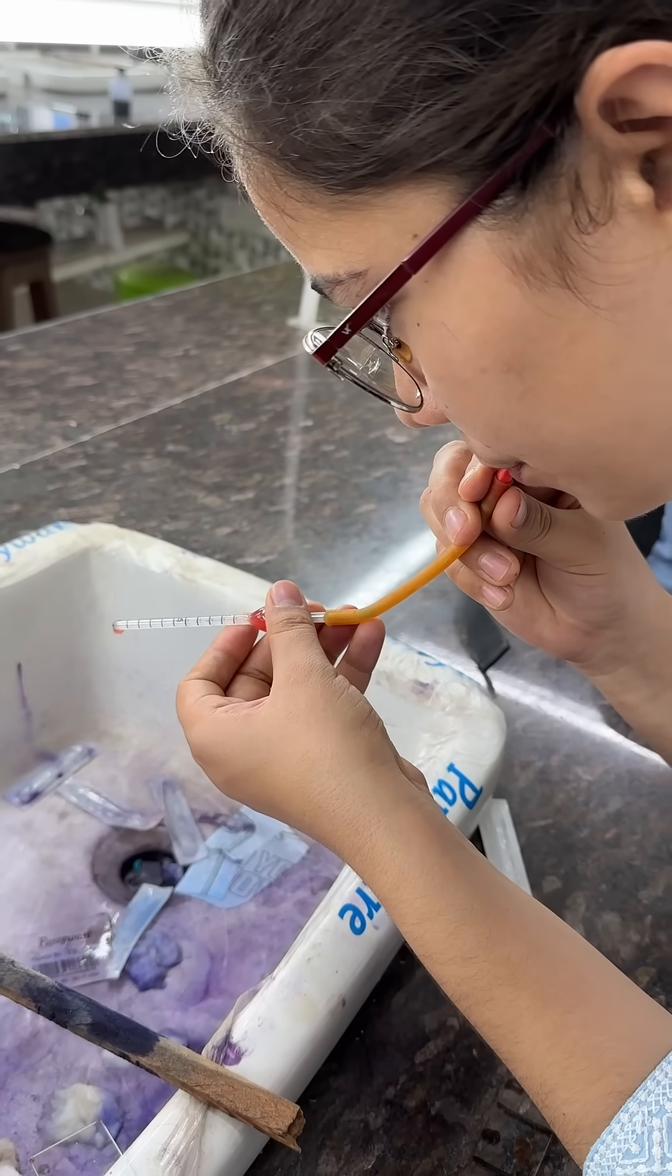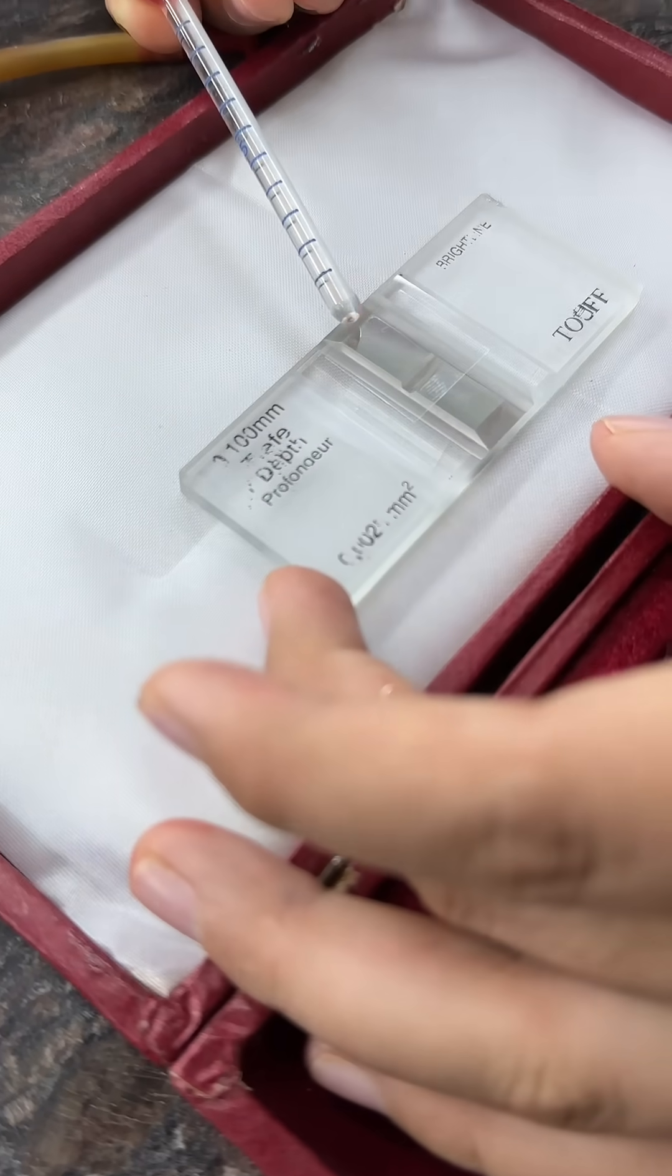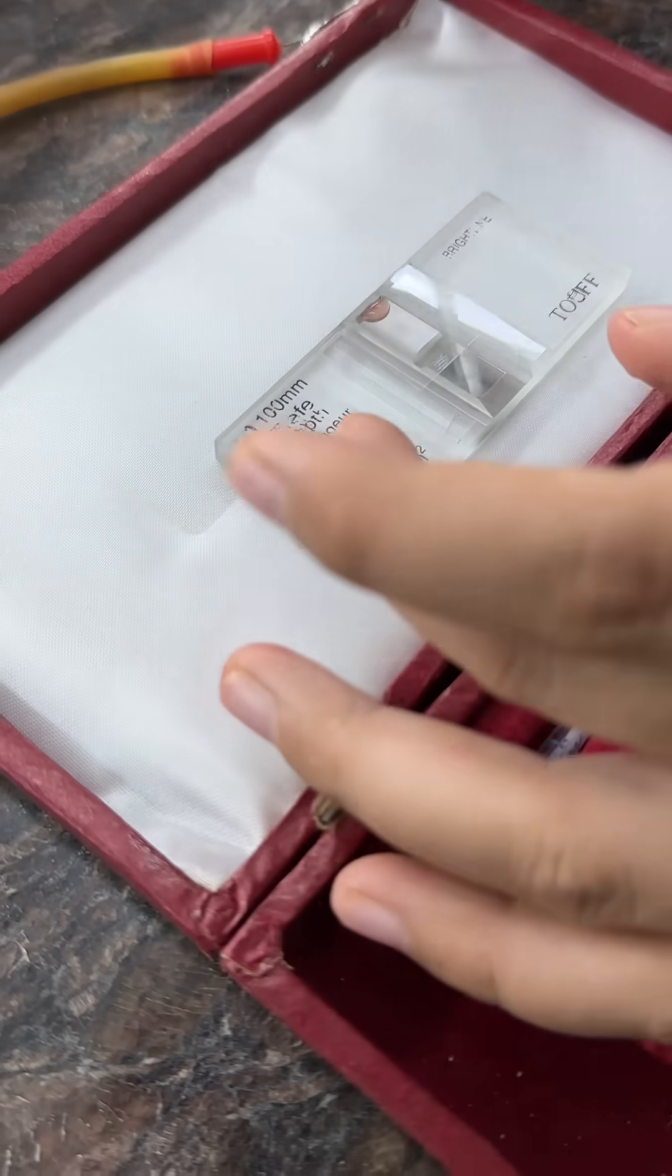Discard two drops of fluid. Now put a small drop of fluid at edge of cover slip. It will be drawn by capillary action, and then wait for five minutes.